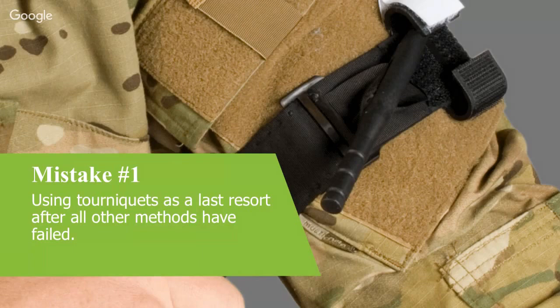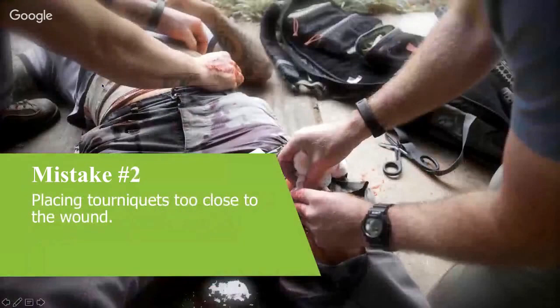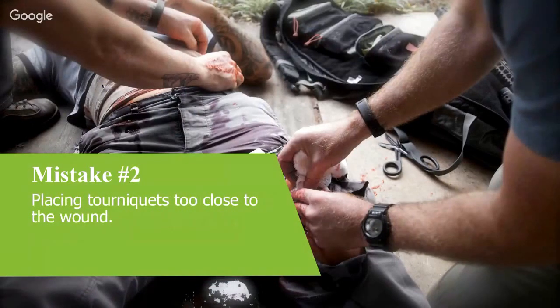All right, Dan, I'm going to hand over to you for mistake number 2 that we see. So for mistake number 2, placing the tourniquet too close to the wound. There's been some interesting debate over the years relating to where you should put the tourniquet. We've gone from initially putting it nice and close to the wound to going high and tight, so above the joint, and then we've sort of come back to agreeing that you can put an effective tourniquet quite low down.